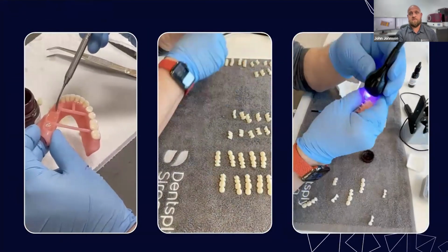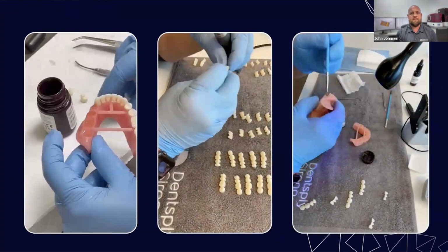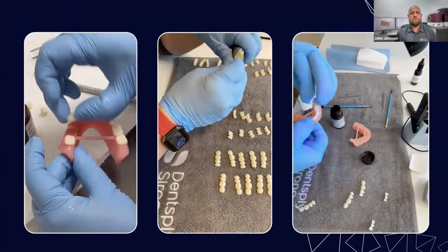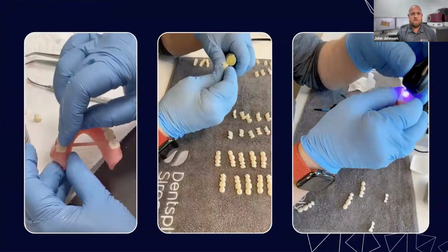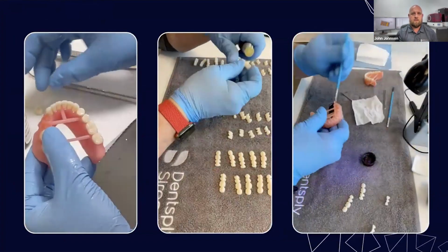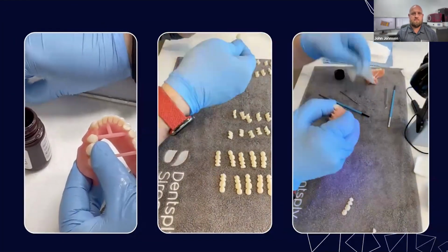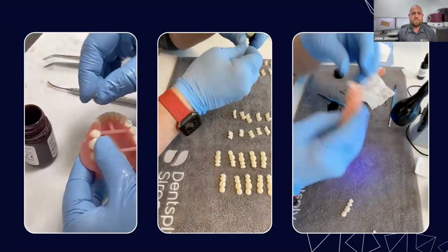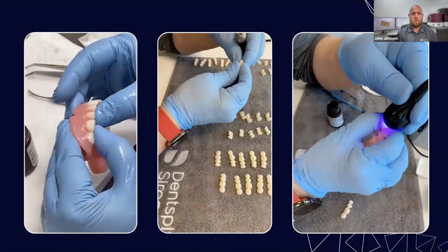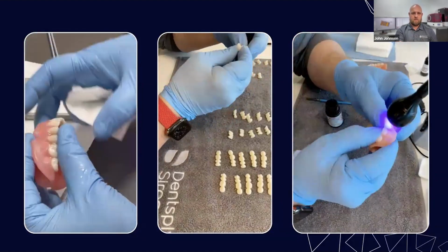And this is just a quick video. The middle video is him prepping that backside. So this is after cleaning, after breaking off all the supports from the print. You've got to go back and manually make sure that those supports are gone, cleaned up, and then you're going to want to dry fit before you start to fuse. Make sure that you get back to that seat that you're wanting, and that ensures that your output is exactly what your CAD was.